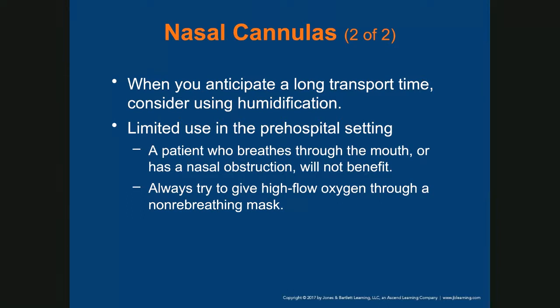Always try to give high flow oxygen through a non-rebreather. Go ahead, Miss Dennis. How much time do you consider an extended period for dry oxygen? If you're going over 30 minutes, okay. The interaction that EMS providers have with the patient will not go beyond 20 minutes, right? In the hospital, you'll definitely have patients on oxygen over 30 minutes.